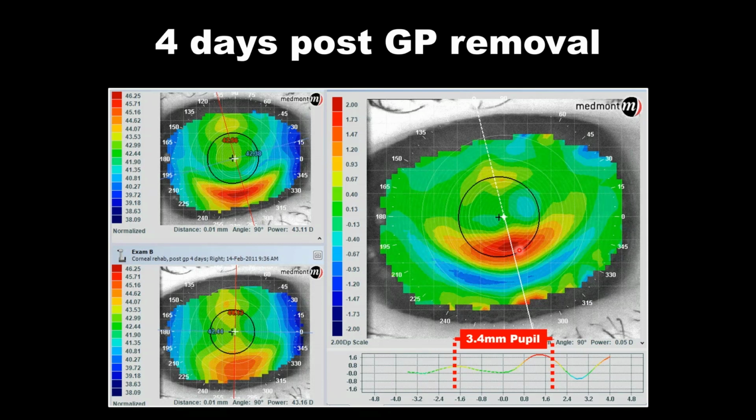Now let's think about this another way. What if this were a 16-year-old kid that appeared to have the signs of possible keratoconus? And should we be sending this patient off for cross-linking? Or is the patient's topography just a droopy apex, a steep inferior cornea? Well, doing a subtraction and comparing this visit to 6 months from now, if there's no change, if the topography comes up all green, that's telling you there's no shift in power over time. So therefore, we are unlikely to need to send this patient off for cross-linking.